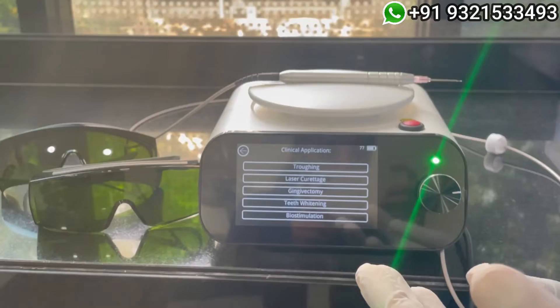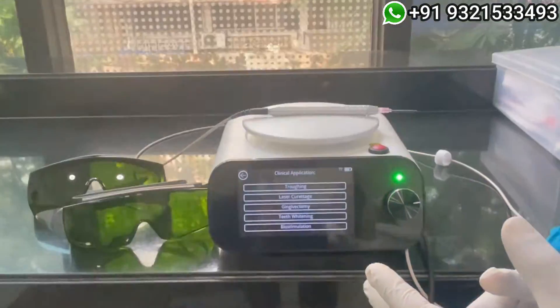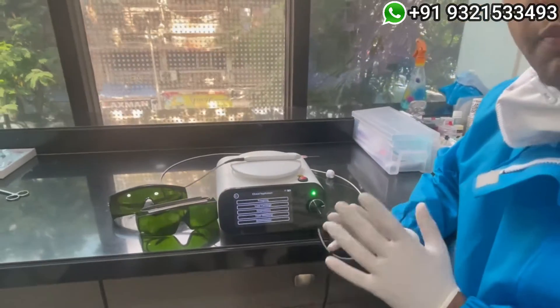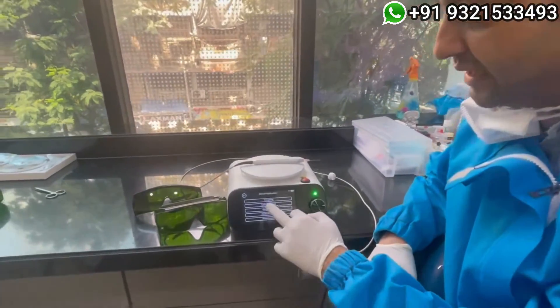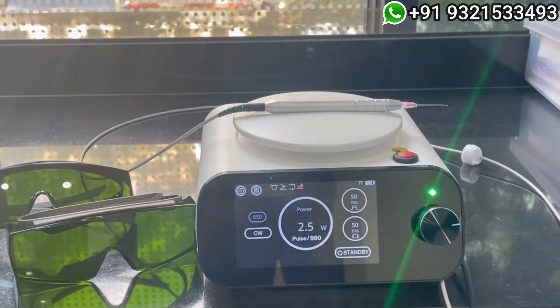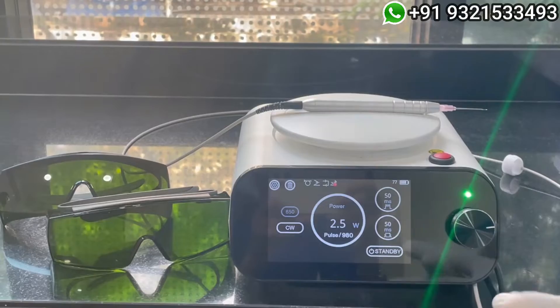Procedures include aphthous ulcers, gingivectomies, crown lengthening, troughing, teeth whitening, and biostimulation — all procedures can be done with this machine. Right now I am selecting the gingivectomy procedure, which gives the option of continuous or intermittent mode.